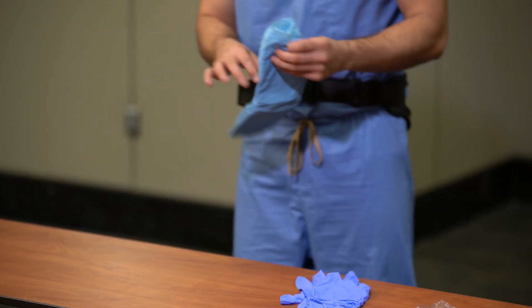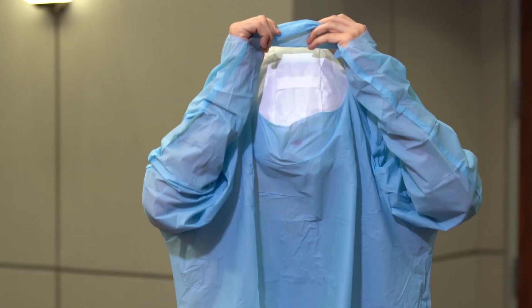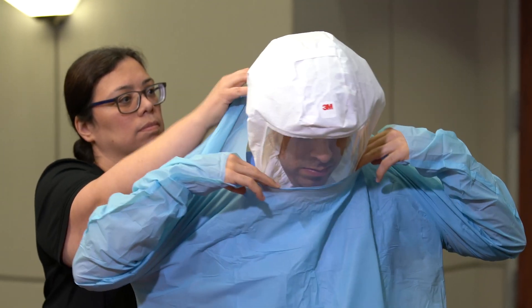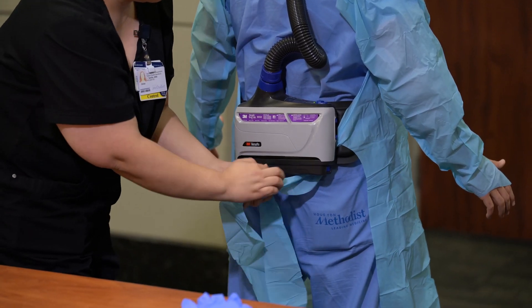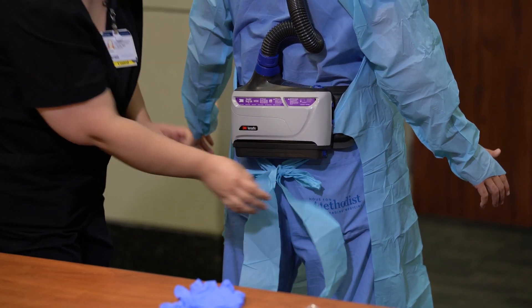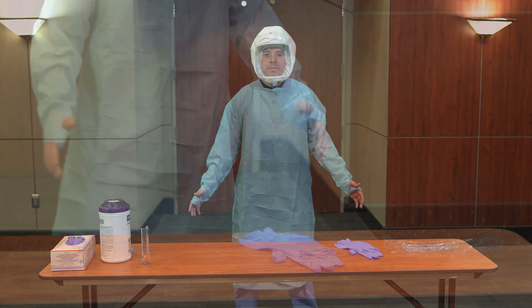Don a blue isolation gown. Slowly don an isolation gown over the PAPR head cover to prevent tearing. The buddy should assist the healthcare worker with donning the gown and tying the isolation gown in the back under the fan assembly. Do not cover the fan assembly with the gown. The gown should fully cover the torso from neck to knees, arms to end of wrists, and wrap around the back.